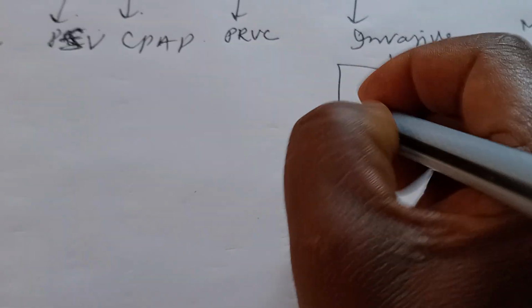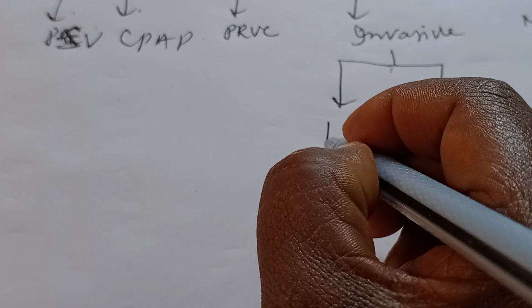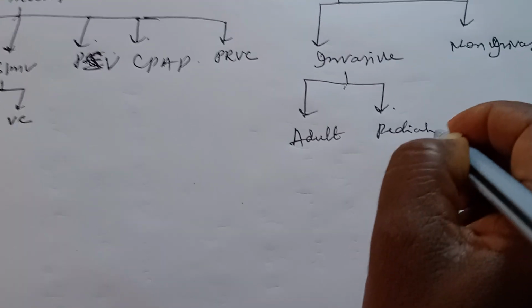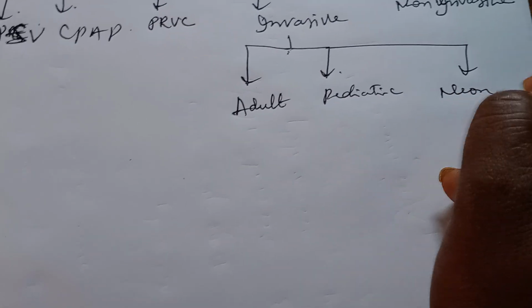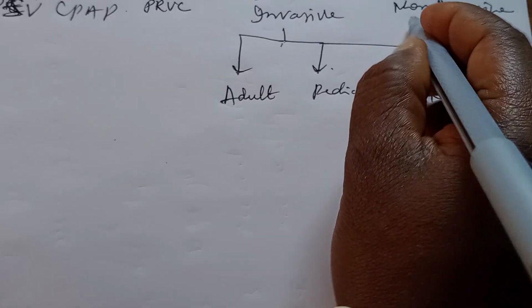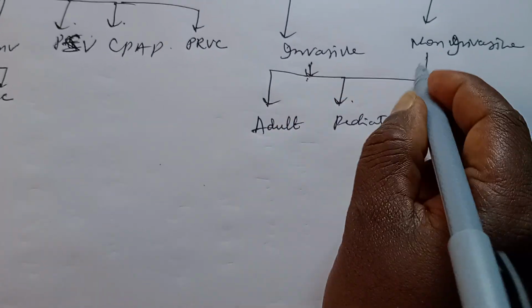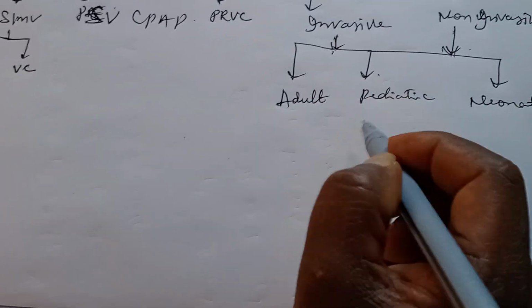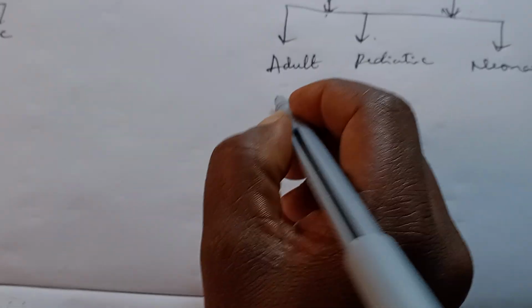In invasive again adult, pediatric, neonatal. So in both non-invasive and invasive, controls or settings will be available: adult mode, pediatric mode and neonatal mode.